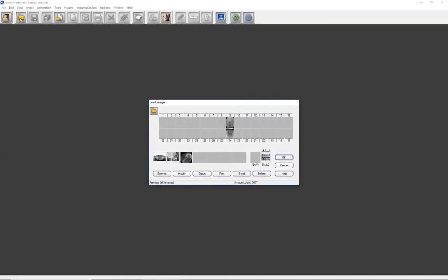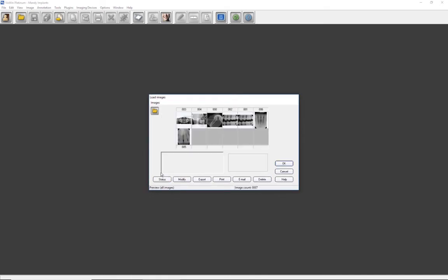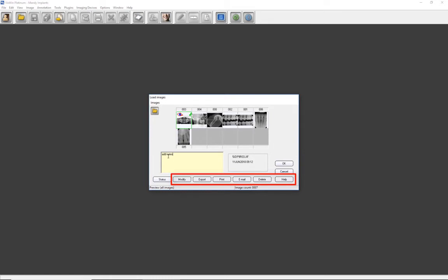Let's close the images and go back to the Load Images dialog window. Click on Browser to go to the Browser view. Images are arranged in chronological order, newest to oldest. Just as in the Status view, images can be selected for viewing, and notes may be added for each image. In the Browser or Status view, you may delete, modify, export, print, or email an image or images.